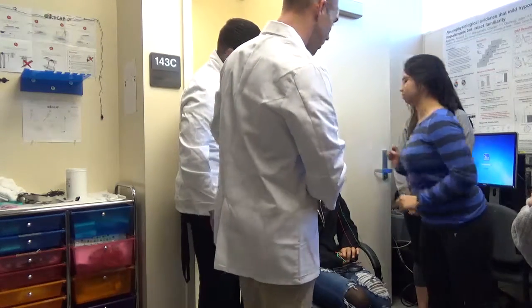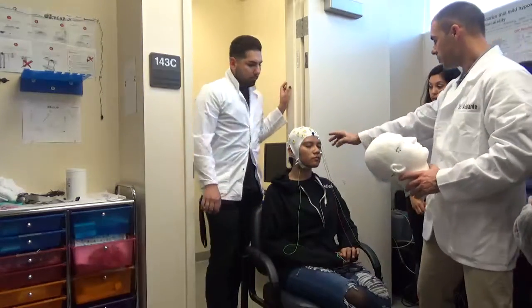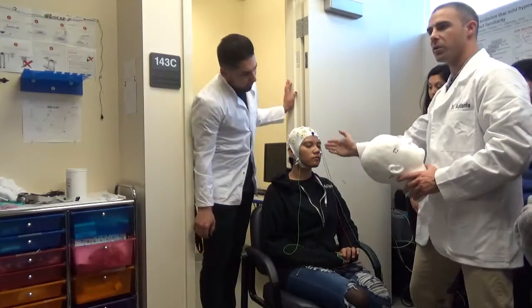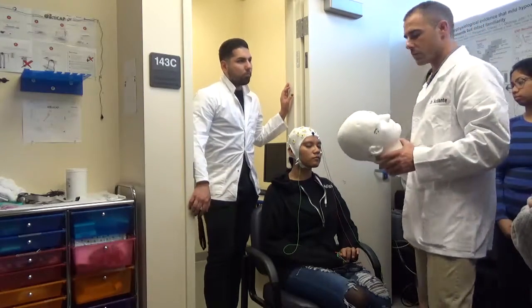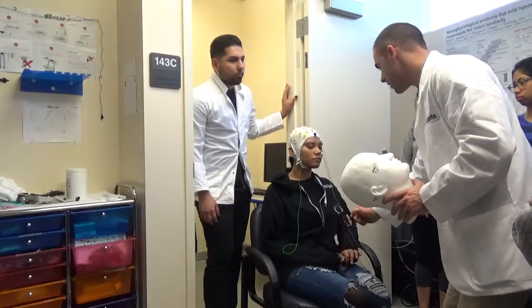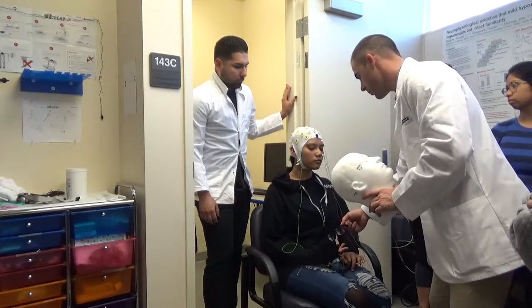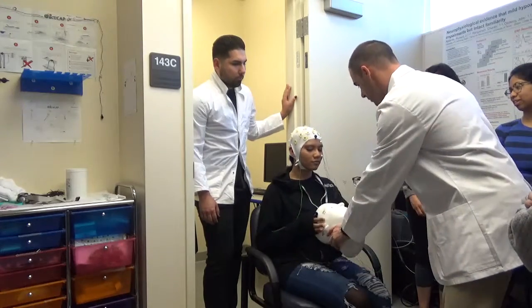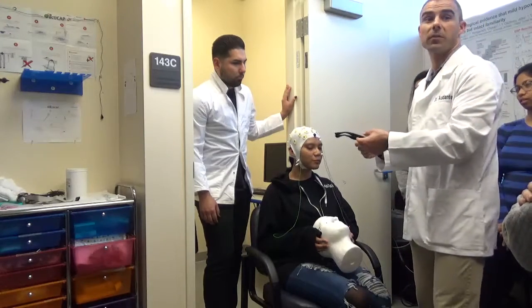Nice. Now the thing you want to keep in mind, and these ladies did this really well, is you want this and this to be basically vertically aligned in the center with their pupil. So that works. Nicely done. And now that we have that done, I can help. Can you hold that for a second? You can open your eyes, and now you can put their glasses back on.